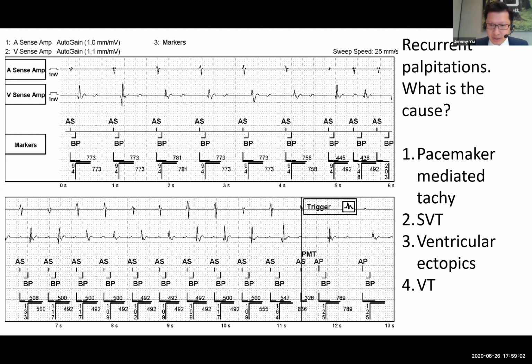And here is a second question: can you comment on the proper placement of external defib pads when a patient has an ICD? Yeah. So all ICDs are designed such that external defibrillation can be performed. The recommendation is to not place the defib pads over the ICD or touching the ICD itself. So the recommendation is to stay about 5 to 10 centimeters away from the ICD device.